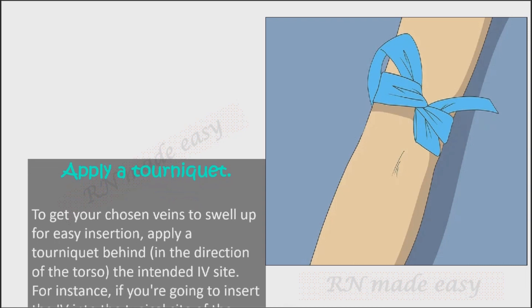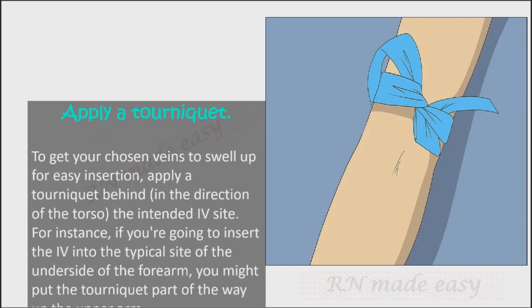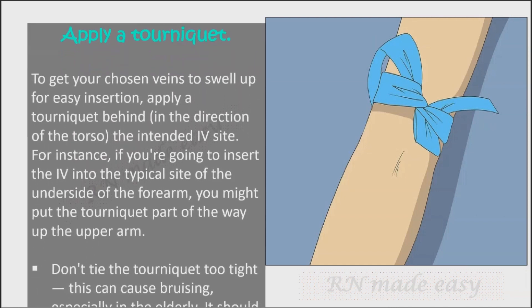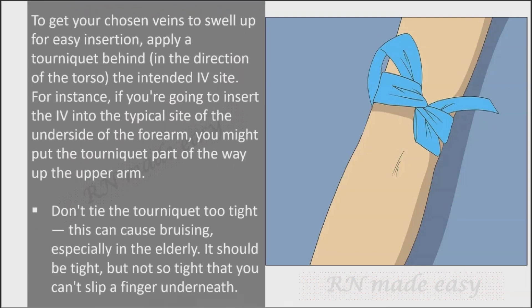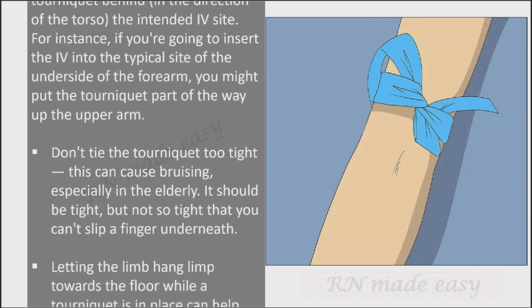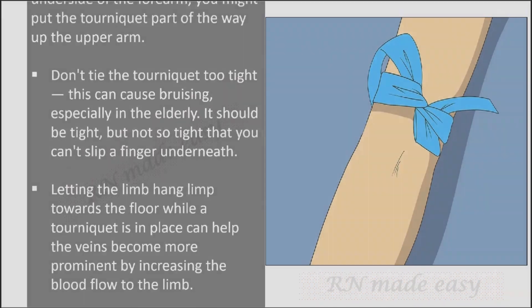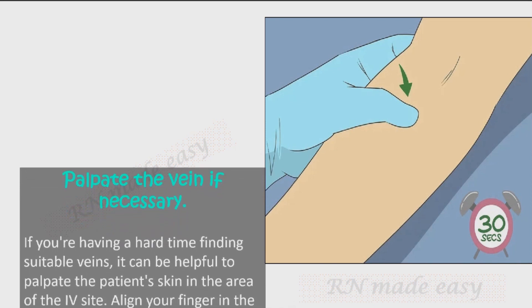Apply a tourniquet to get the chosen vein to swell up for easy insertion. Apply it behind — in the direction of the torso — relative to the intended IV site. Don't tie the tourniquet too tight, as this can cause bruising especially in the elderly; it should be tight but still allow a finger to slip underneath. Letting the limb hang toward the floor while the tourniquet is in place can help veins become more prominent by increasing blood flow.